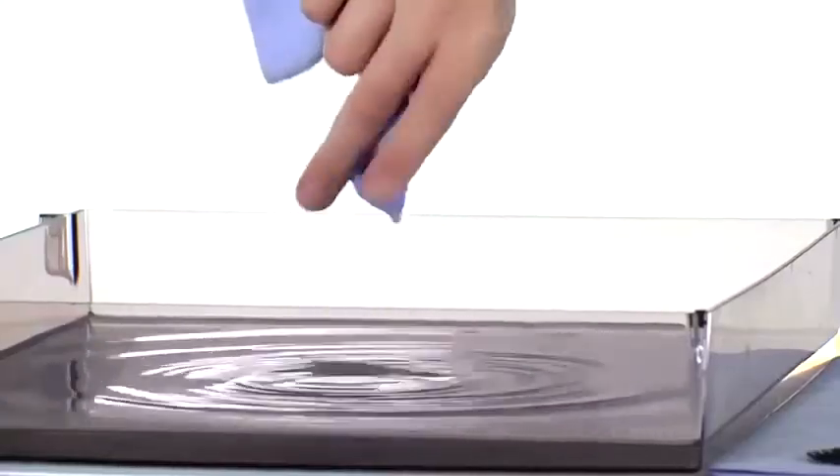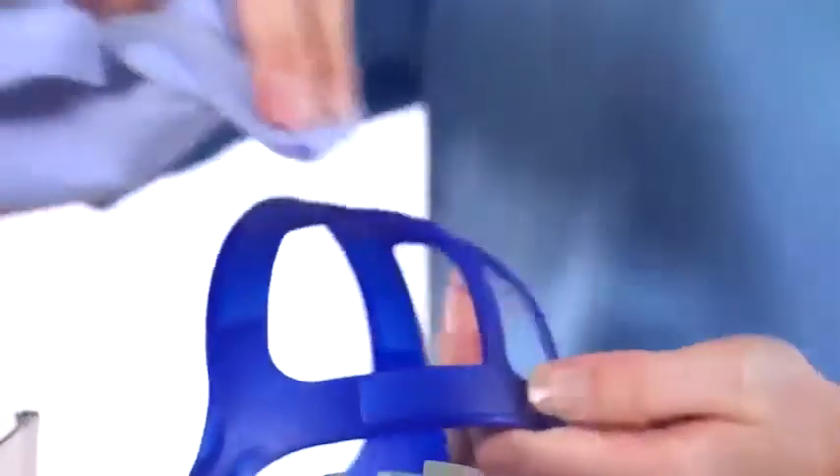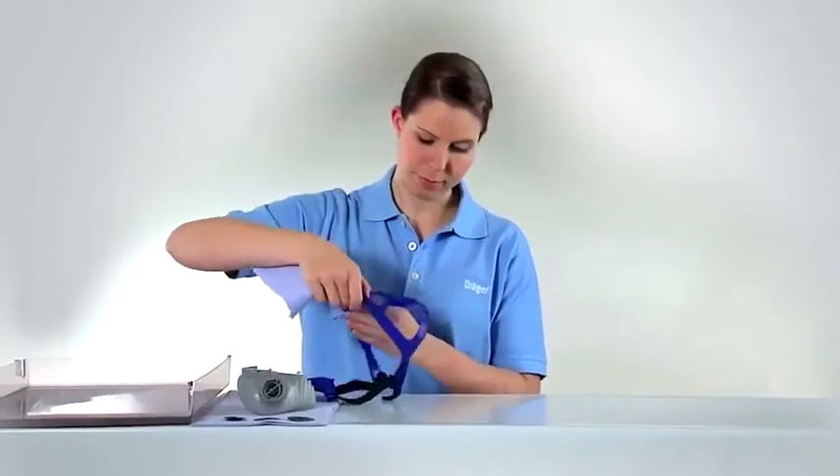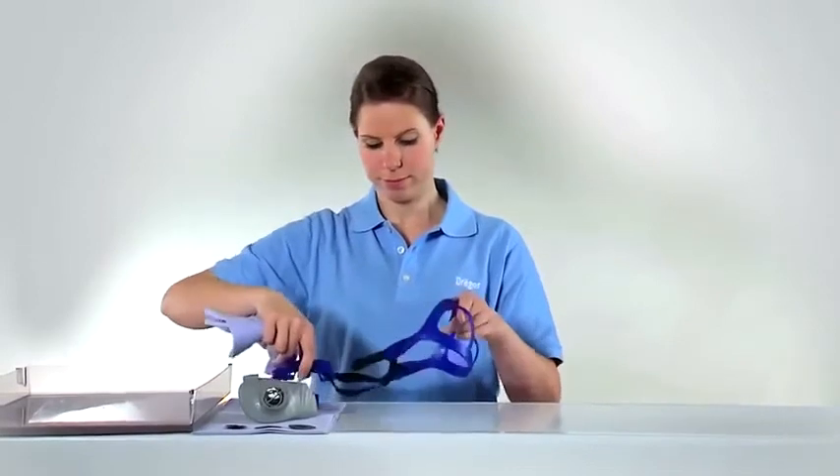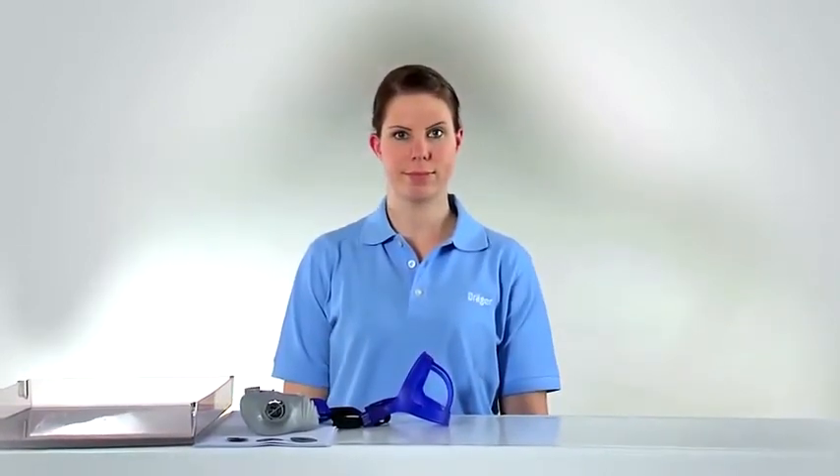The mask body and head harness should be cleaned with an all-purpose detergent and rinsed in lukewarm water. For recommended detergent, see the IFU. In addition to the cleaning, a disinfecting should follow using the disinfectants listed in the IFU. Afterwards, rinse thoroughly in running water.